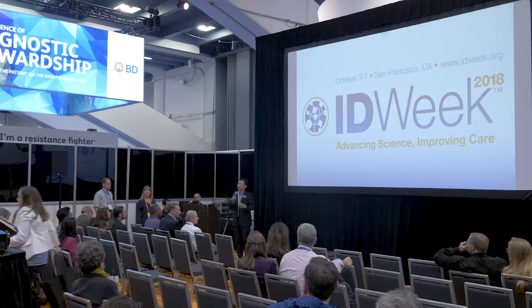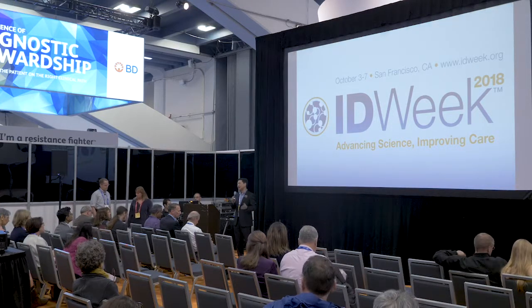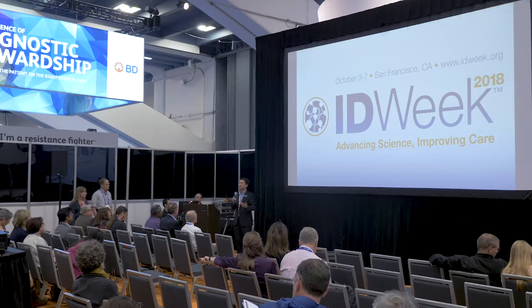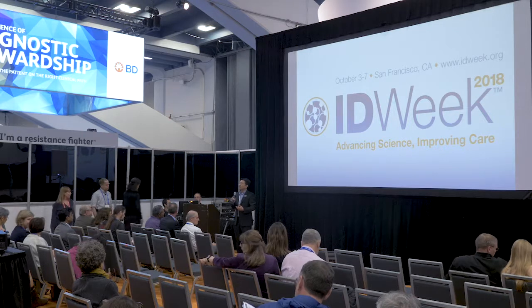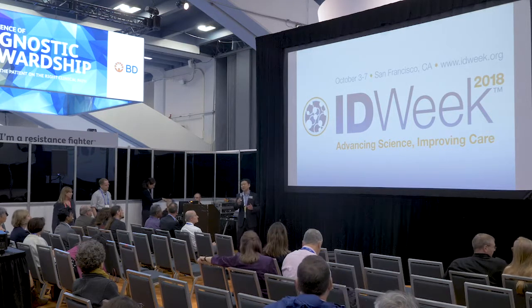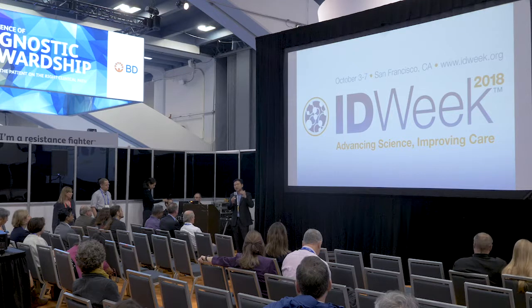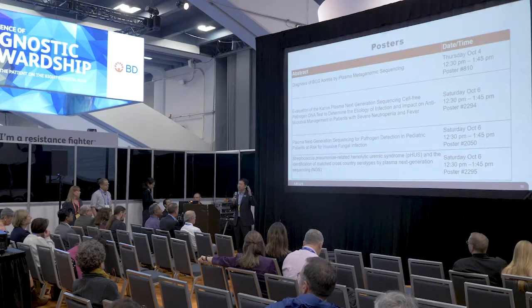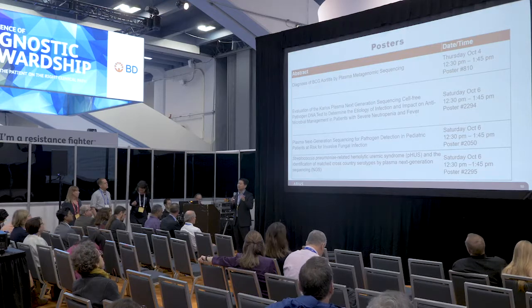In the interest of time, I just want to highlight a couple of things that are going on at IDWeek. We have a number of other presentations, both posters today and on Saturday. Also, there will be an oral presentation with our collaborators from St. Jude's. This is data from a study that we call the PredSeq study, using our test to predict bloodstream infections in high-risk leukemic patients. These patients were serially sampled as they became neutropenic on chemotherapy. And what we're doing is trying to use the test to identify bloodstream infections before blood cultures are positive.